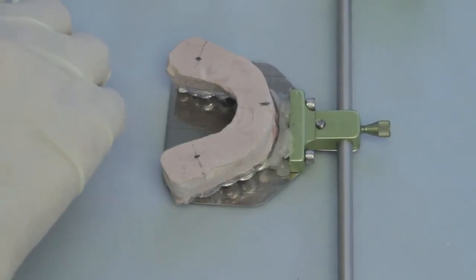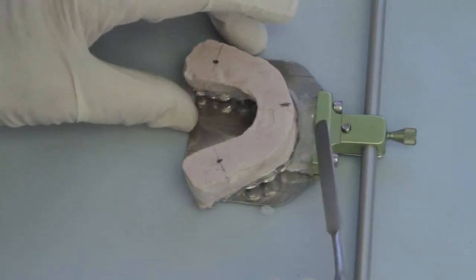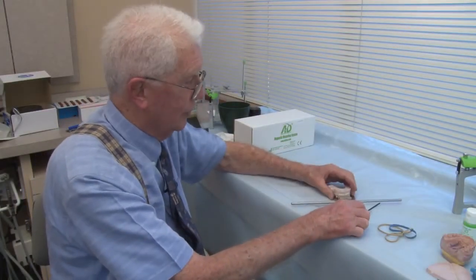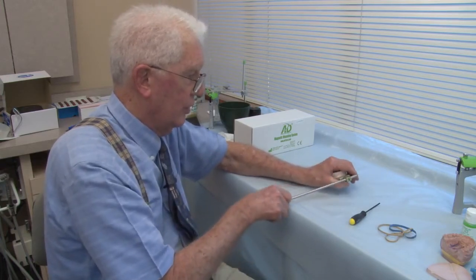Now then add a little more acrylic as needed. Okay, now then we just let that set. The next thing that we want to kind of finish up with is we've made our clutch here, and so let's just take it apart.